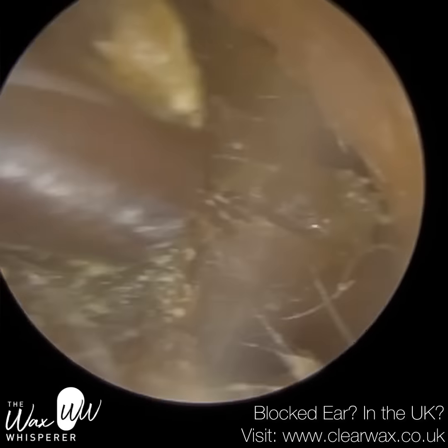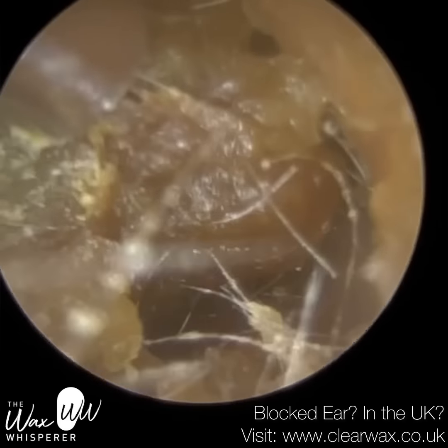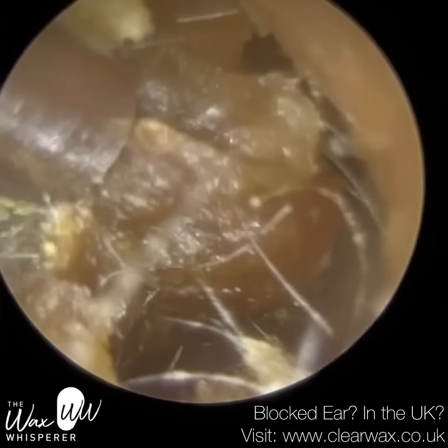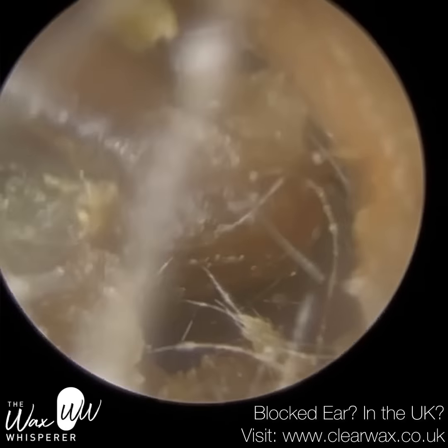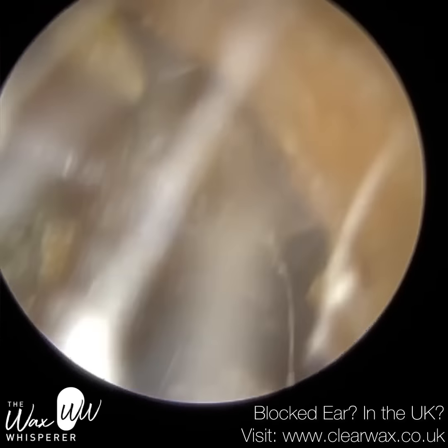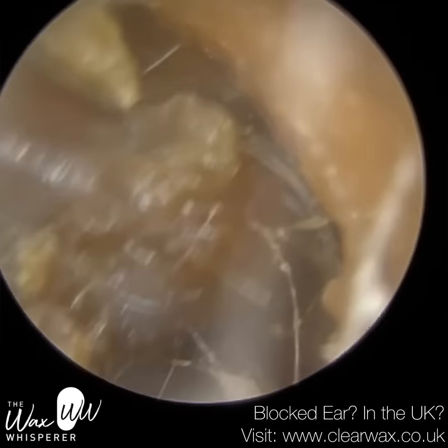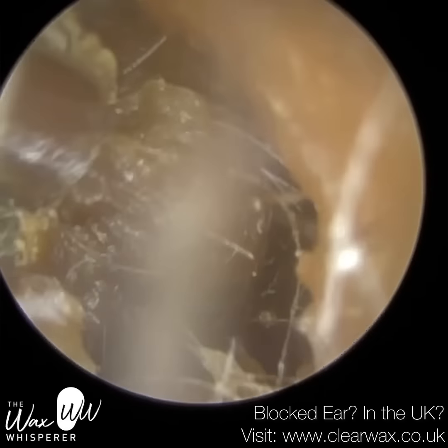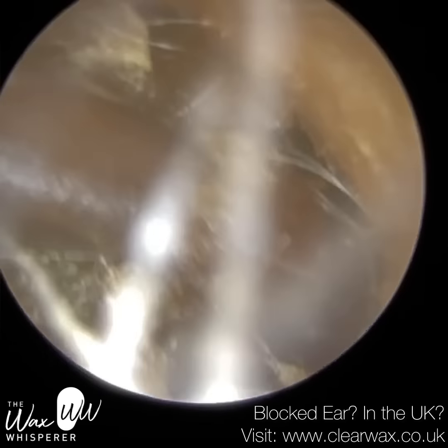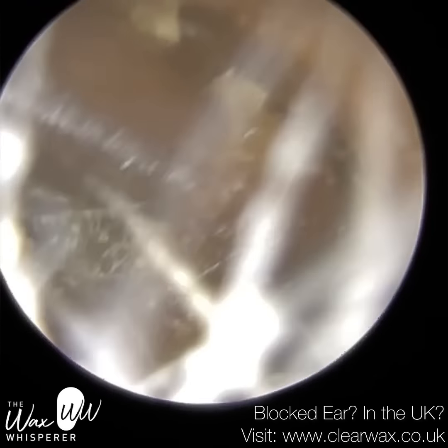Now the term pars — we normally use it when describing the anatomy of the eardrum. So the main body of the eardrum, about 80% of it, we call that the pars tensa. And then the top section of the eardrum, above the short process of the hammer bone, we call that the pars flaccida.